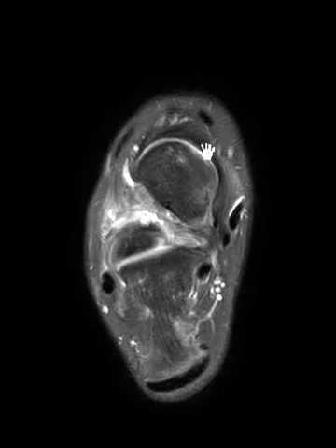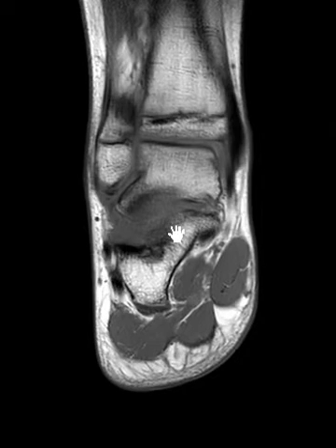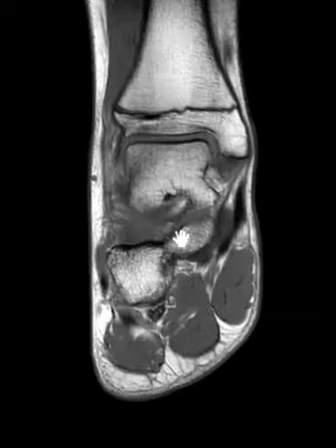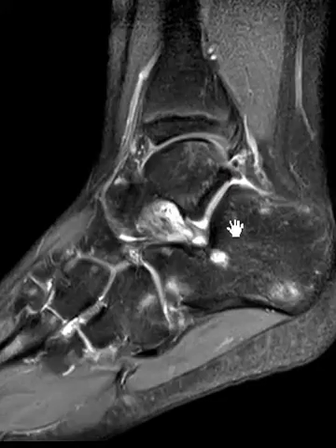With a history of prior trauma, we suspect a sinus tarsi tear. To evaluate the sinus tarsi, I look on a sagittal T1-weighted image for bright fat. On this coronal T1 image, the fat is not bright — normally you should see bright fat and a few thin ligaments in the sinus tarsi. Here, the fat is obliterated and replaced by darkness, so the sinus tarsi is diffusely abnormal and something is going on.